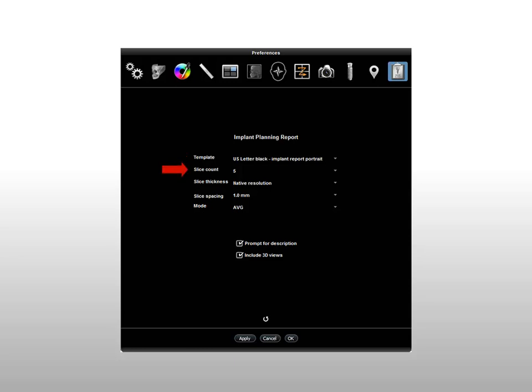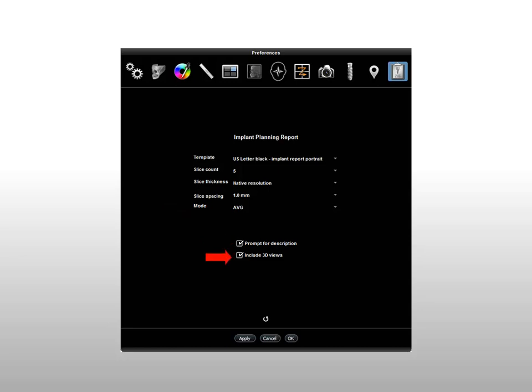Additional preferences include Slice Count, Slice Thickness, Slice Spacing, Mode, Prompt for Description, and Include 3D Views. Click Apply to save the preferences.